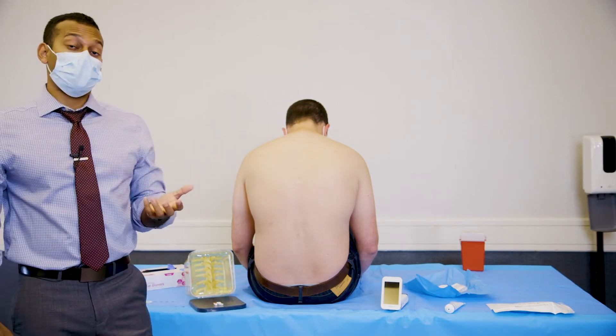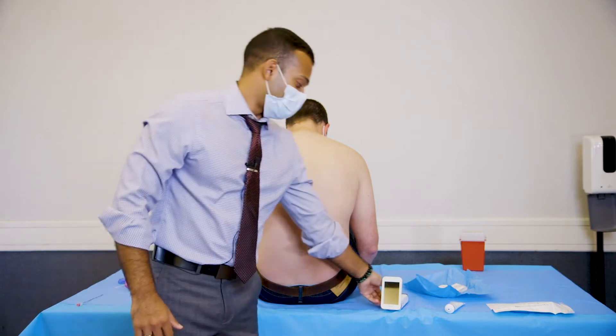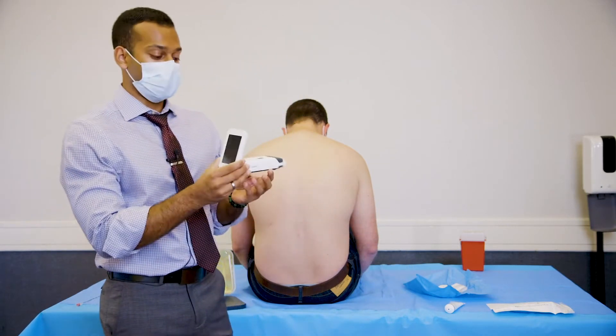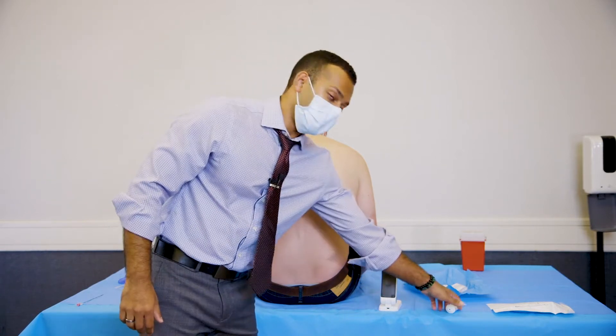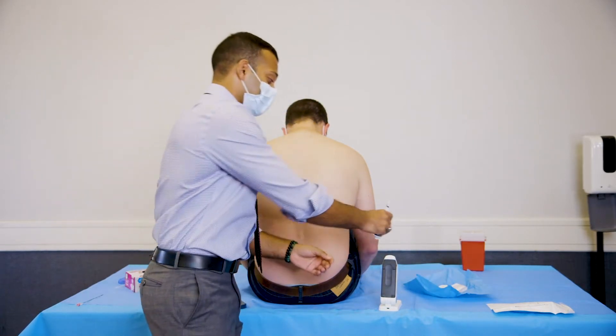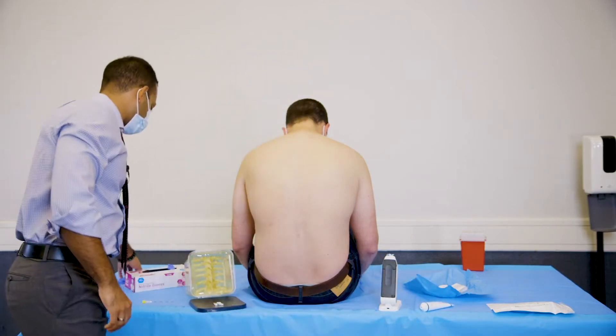The next thing you want to do is prep the Acuro spinal navigation system, and we need to do this sterilely. You're going to take your device, place the screen facing down with the back end pointing up. You're going to put your non-sterile gel on top of this and then put on your sterile gloves.